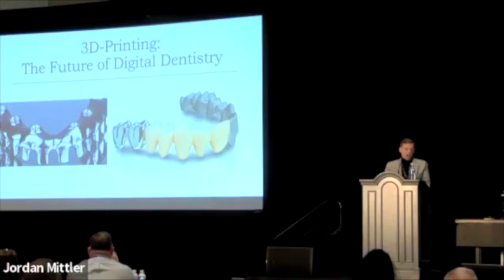So I foresee a future where we'll be able to metal print a chromium cobalt or titanium bar with a resin superstructure on top of that. At least if you have a maxillary zirconia arch with this as the mandible, you prevent clanking, and have either a great long-term provisional without worry of breakage, or even a final, definitive restoration.